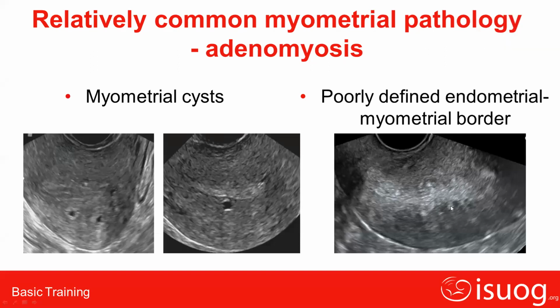These are endometrial lines. Endometrial lines are coming straight from the endometrium. And these are the endometrial buds, which are again coming from the endometrium and going inside. How can you find them? Many times this is so difficult to find.